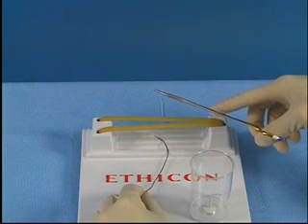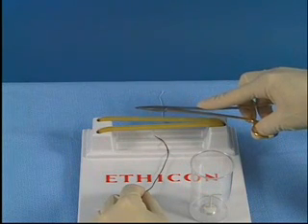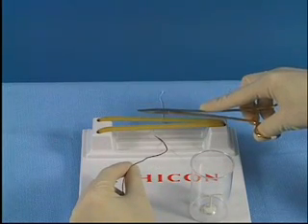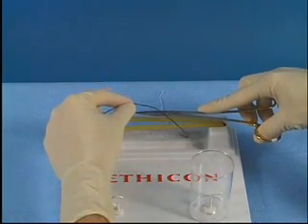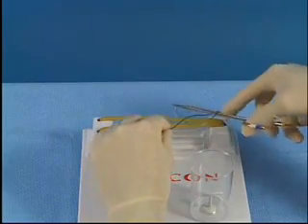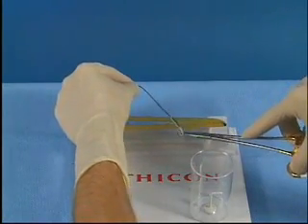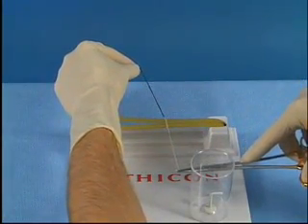To perform an instrument tie, the needle holder is placed over the incision between the two strands of suture. The suture is grasped in the non-dominant hand between the thumb and the index finger. The suture is brought from your near side and wrapped around the end of the instrument. The needle holder is then used to grasp the other end of suture and is pulled towards the surgeon, tightening down the first throw.